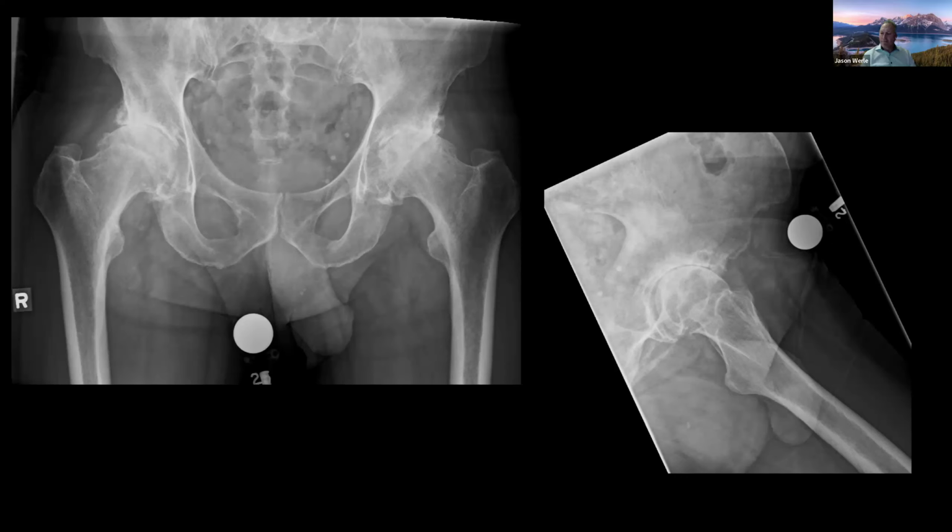Yeah, I agree with Seb. I consider myself also an anterior guy, but I do care about spine pathology, even though I am an anterior guy. A couple of things I look at when I look at these X-rays: I look at the femoral canal distally. What is that diaphysis? Is it a Dorr A, Dorr B type canal? Is there a metaphysis-diaphysis mismatch? Will I have to try to open up that distal canal to have a nice fit proximally?